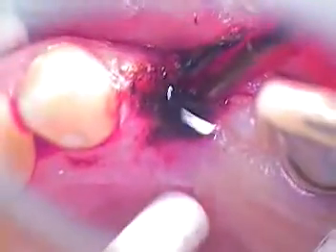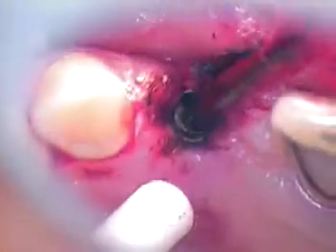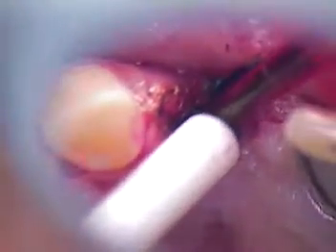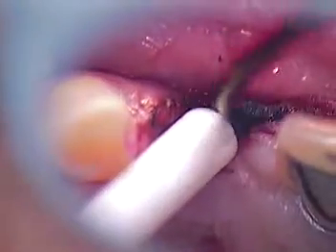Go ahead and suction that again. So we're going to do microbrush and TNS, which is the tartar and stain next. Let's see what comes up out of those.